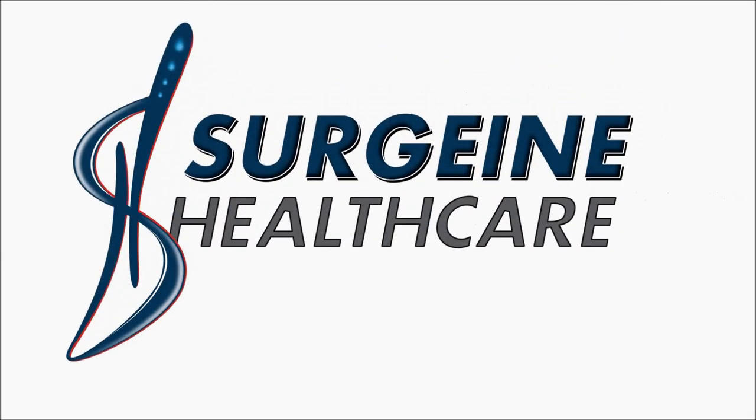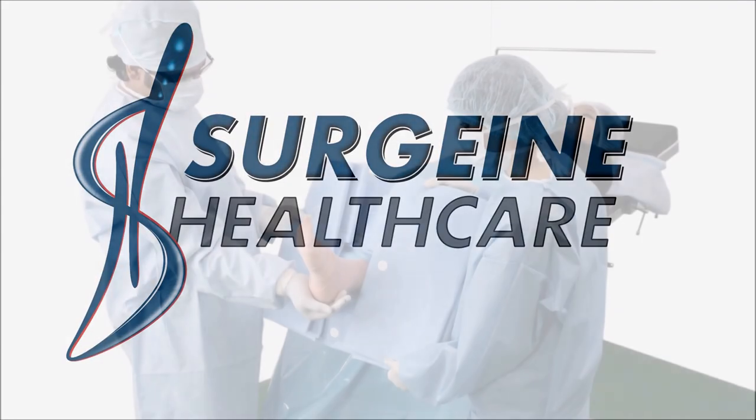Draping instruction for knee arthroscopy drape, for various surgeries by Surgeine Healthcare India.